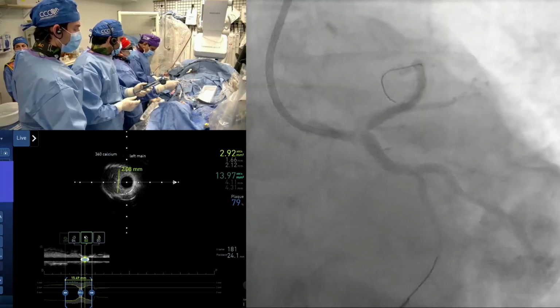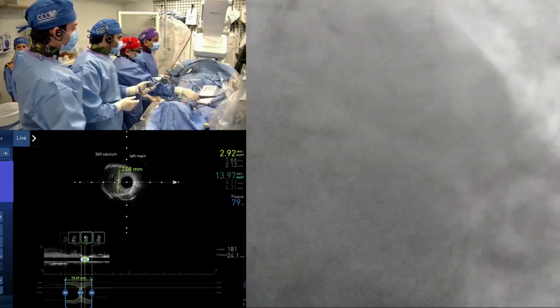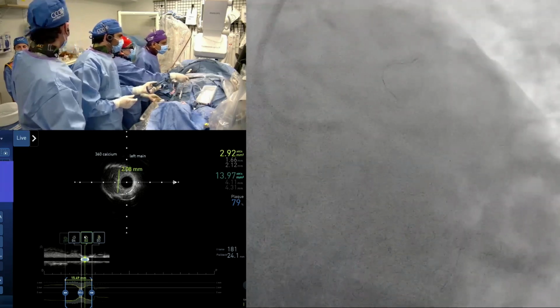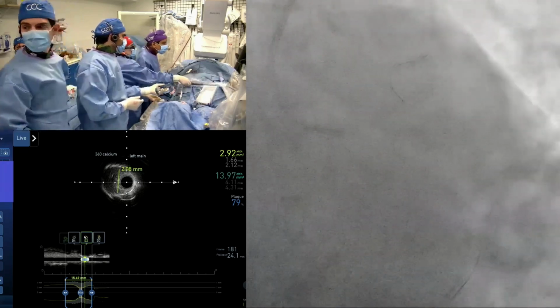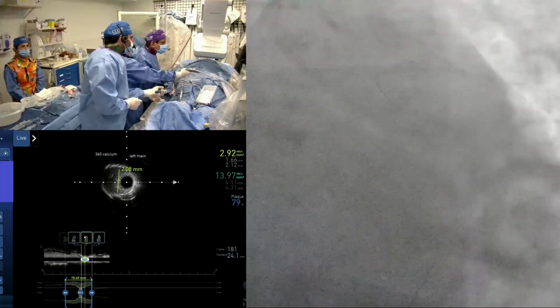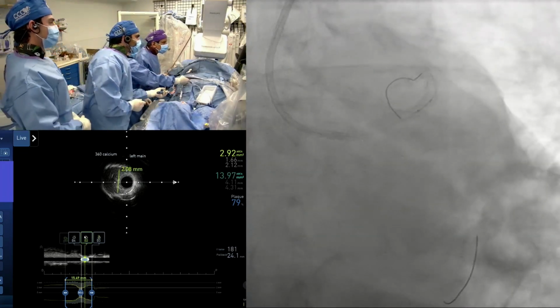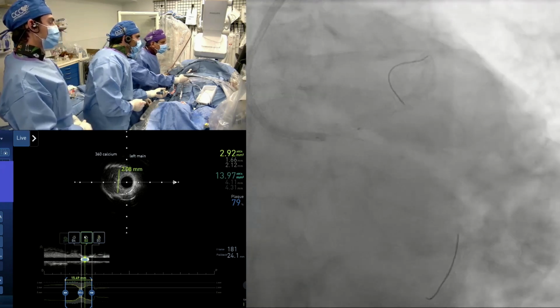You have so much calcium. I don't know any other ideas from the panel. Judge, you also have a microphone there. If you want to make a comment, you just give us a talk on the IVL. I think right now the lumen is 2.0, just exactly the same as the rotablator. So everything else was rock hard outside where the rotablator burned. And we really need to go very, very big diameter here.